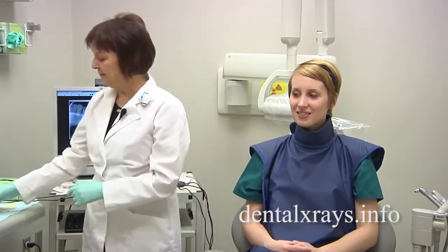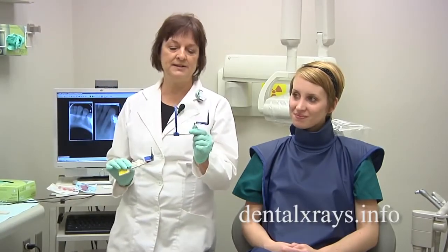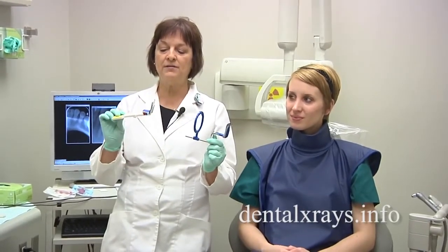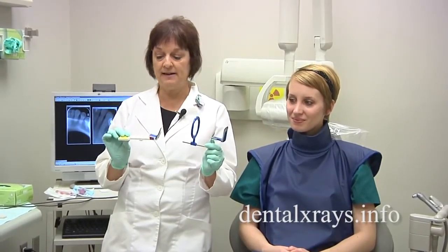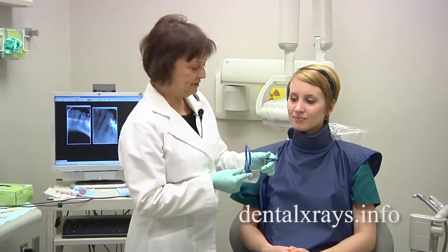There are different pieces that you may want to use. Some offices always use the REN instruments — they're great. Or some offices use the bisecting angle technique. I'll start with the ring and show you how to do a few anteriors.